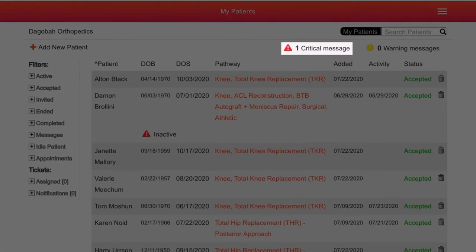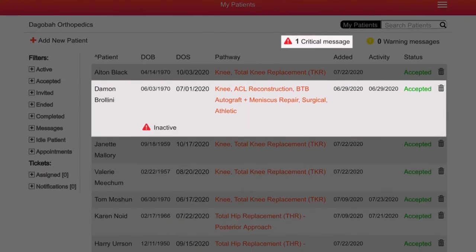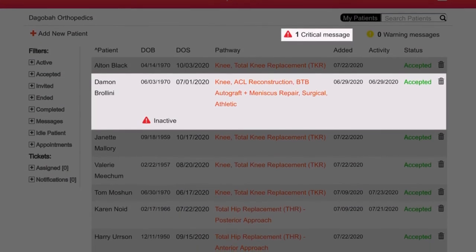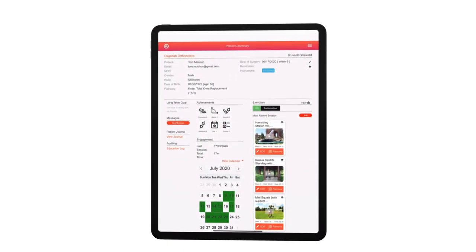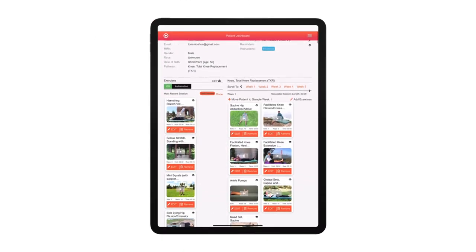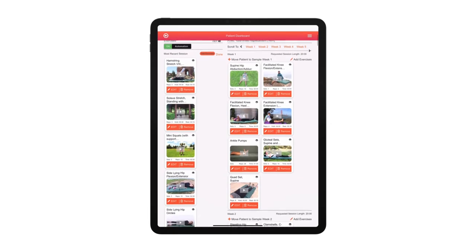Alerts indicate which patients are not meeting recovery benchmarks or may need intervention. Surgeons and physical therapists can adjust the patient's rehab program or change their exercises.